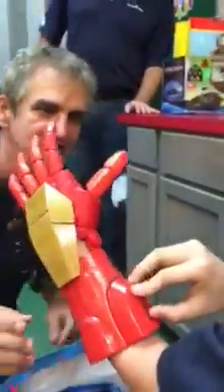Put it on. We're going to set it up for you. And now turn on this button. Push that button forward. Turn that button. Now hold your arm up. Hold your arm. Look. Put it straight up. Crazy.